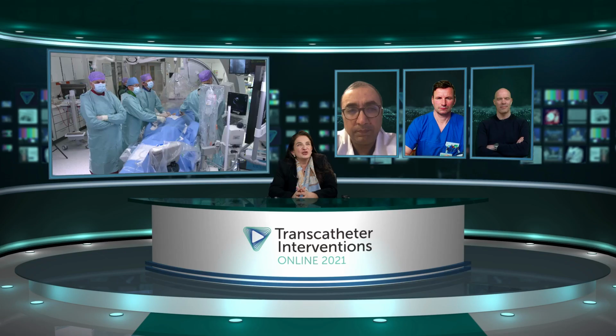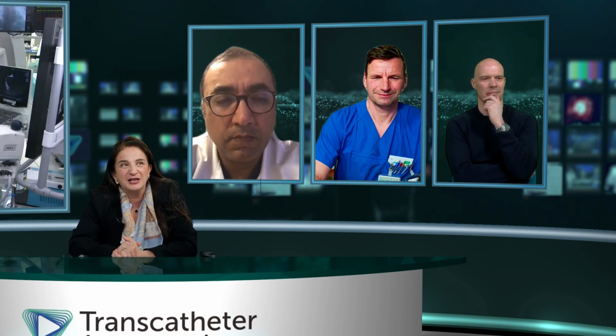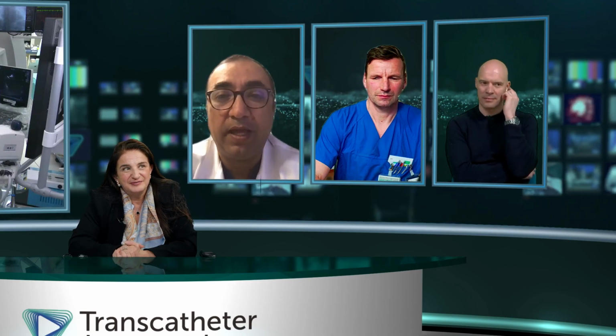Excellent, great. So let's start with you, Azeem. What's your thought about the planning of this case, which is so beautiful? I think this is futuristic, a new device, a whole new way of treating patients with left atrial appendage closure. I think they clearly did really detailed planning, using a combination of CT plus also 3D printing to better understand the anatomy. It's really state-of-the-art planning, and you couldn't do better.